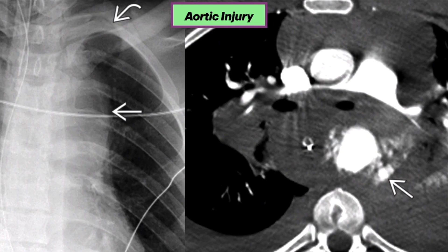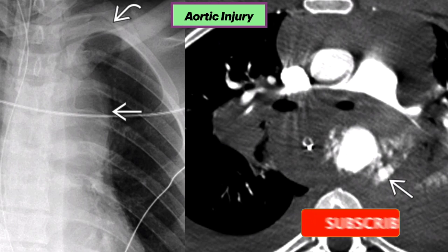The next case is an aortic injury. Chest x-ray on the left shows a left apical cap. There's also rightward tracheal deviation. The paratracheal stripes are thick, and there's loss of the aortic arch and the aortopulmonary window. The axial CT angiogram on the right of the same patient shows active contrast extravasation from the ruptured descending aorta with a large mediastinal hematoma producing mass effect on mediastinal structures. Note the large left hemothorax, which causes the apical cap.